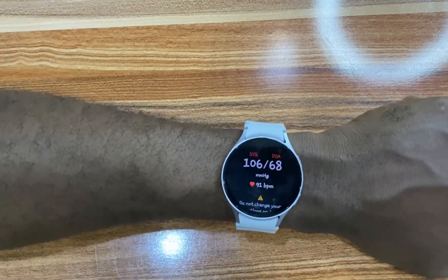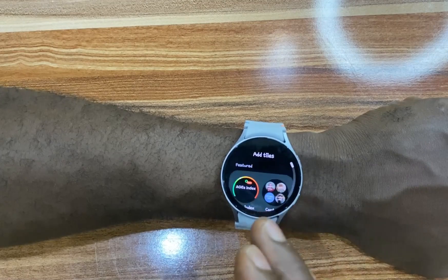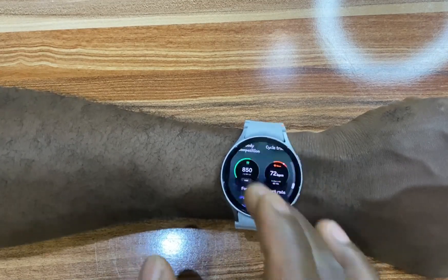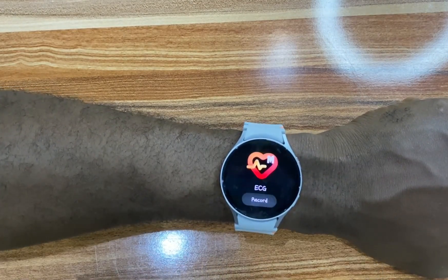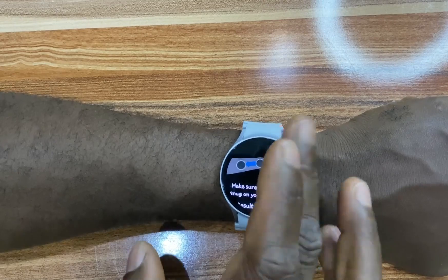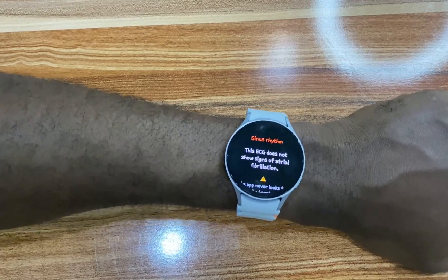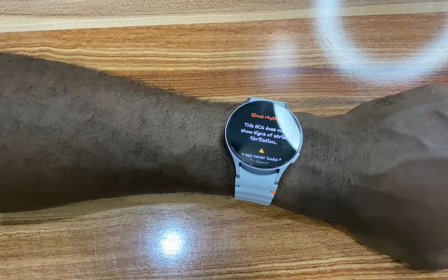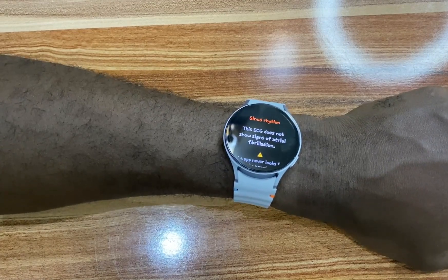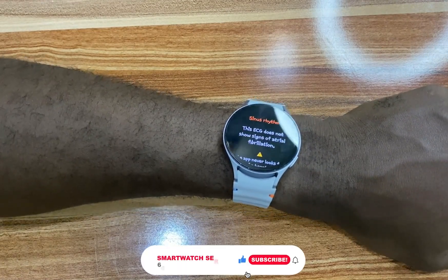We can now go ahead and take our first ECG measurement. Go to the list on the watch, tap on the plus icon, and locate ECG. That is how you can install and set up ECG and blood pressure on your Galaxy Watch 7, Galaxy Watch Ultra, Galaxy Watch 6, Galaxy Watch 5, and Galaxy Watch 4.